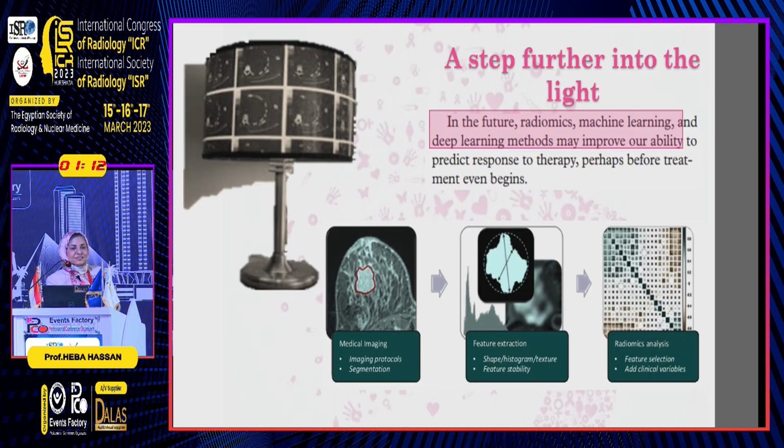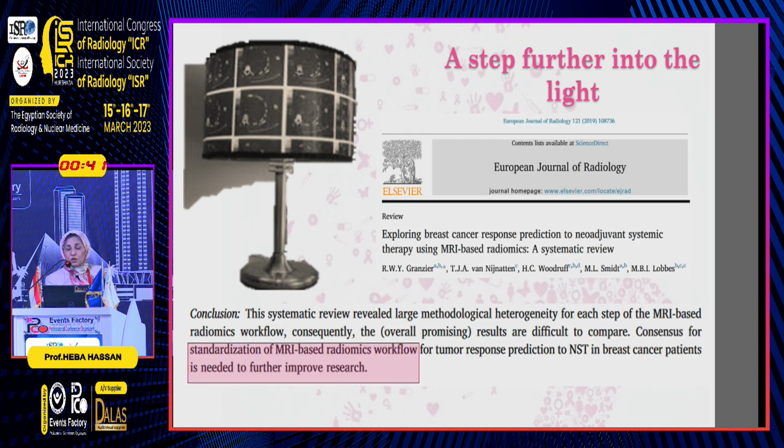So is this it? Well, there is, of course, AI nowadays and radiomics and deep learning of the machines. As you already know, they are feeding the machines with lots of data according to the morphology, the enhancement pattern, diffusion, spectroscopy, in addition to the clinical, molecular, subtyping and types of treatments, so that nowadays they aim to look at the baseline MRI and just give you a clue if it's going to be a responder or non-responder from the start. So, though it's still not standardized, it's showing promising results.